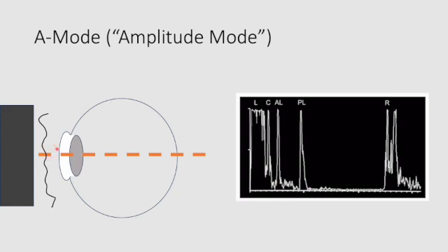And then those sound waves hit the cornea. And there's a big difference between the texture and density and the impedance values of the soft tissue and of the cornea, so we expect to see a strong echo signal. And sure enough, when we look over here on the right, that's what we see. Then we move into the anterior portion of the lens and the posterior portion of the lens, with both of those barriers also demonstrating really strong peaks. And then lastly, the echoes travel through the vitreous to the retina, where there's another change, and we see the retina peak back here. So echoes are being generated at each of these boundaries and result in an amplitude that we can see on A mode. Pretty simple, right? It follows the physics we talked about.